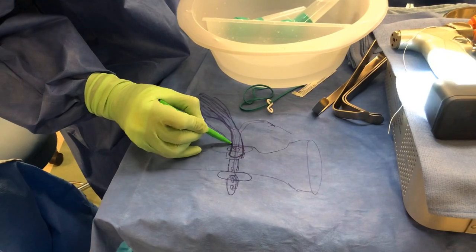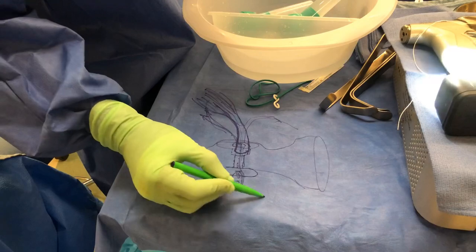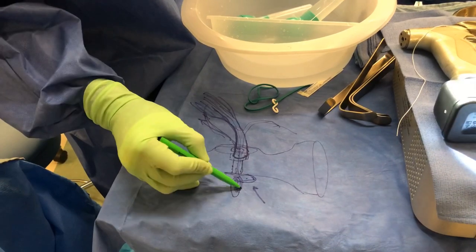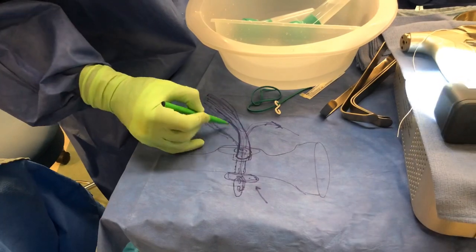So now this tendon is actually inside a bony trough, and the sutures that were pulled get tied. This is the metallic button that acts as a toggle bolt — it cannot come out as long as the sutures do not break, and they do not break because these sutures are braided.